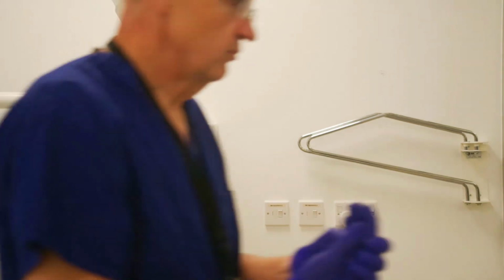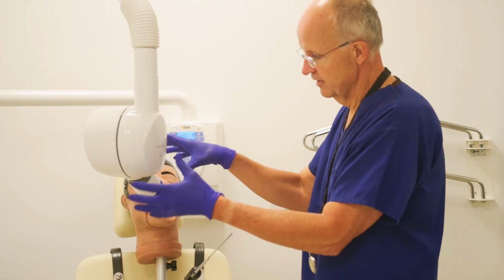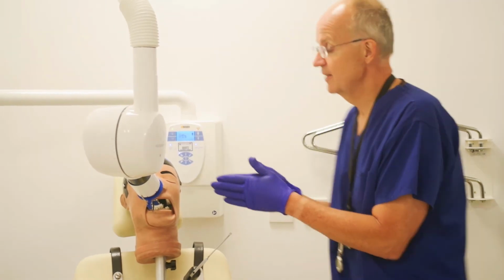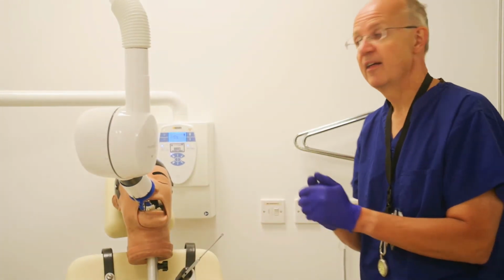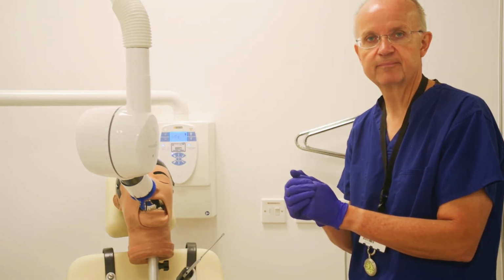Okay, so just to repeat that, you can't do everything from one side. You're trying to line something up in 3 dimensions and you're using 2 lines at right angles to do that. So you have to look at right angles to that line and come round here and look at right angles to the other. That will enable you to get it perfectly lined up and give you a really good radiograph.